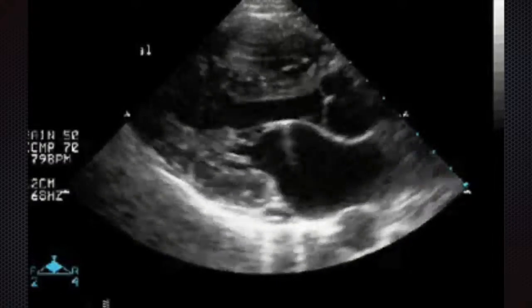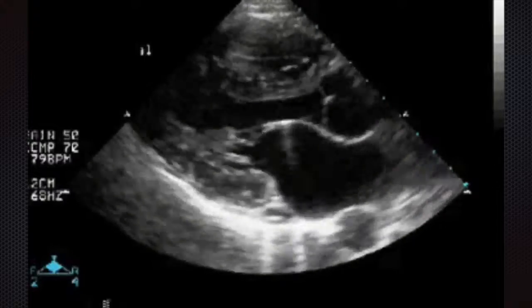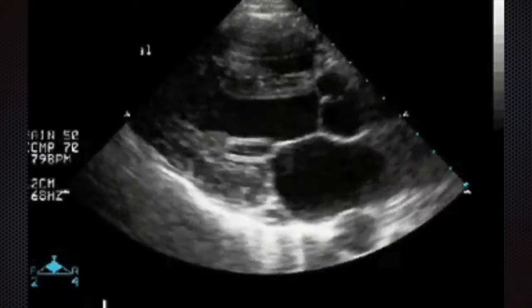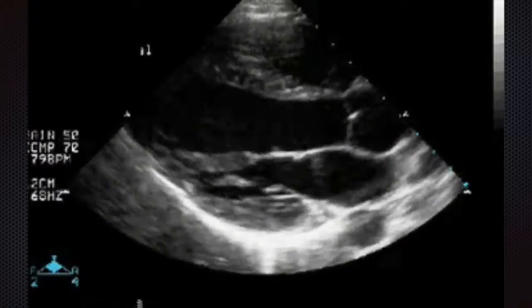So you can see this is the left atrium going through the mitral valve into the left ventricle, and then blood is being squeezed out during systole through the aortic valve that opens and the root of the aorta. So the root of the aorta is a bit like a spring onion. It has a slight bulge at the base, and then it goes up obviously to the arch. And as you can see, it's quite dynamic, so it's preferable for your heart to be beating all the time. That's why you assess it in different phases of the cardiac cycle.